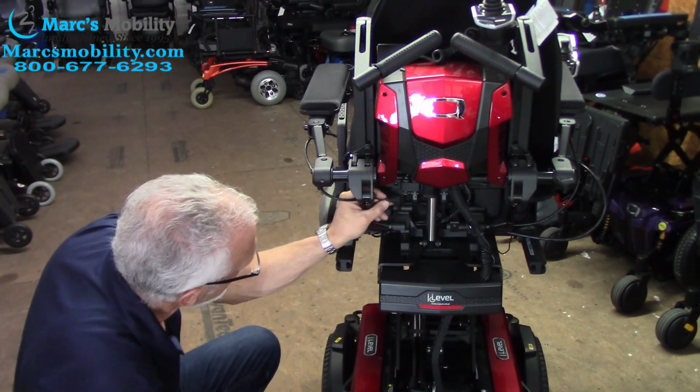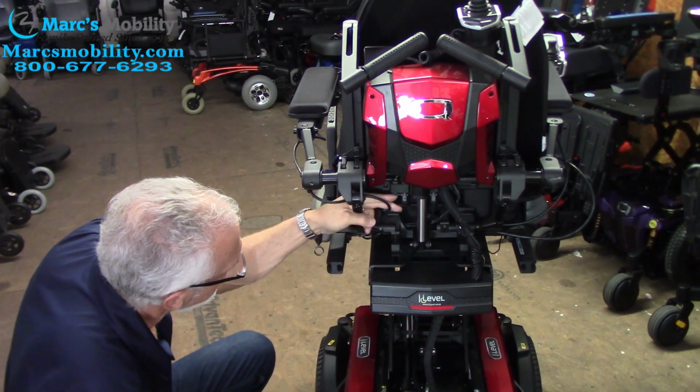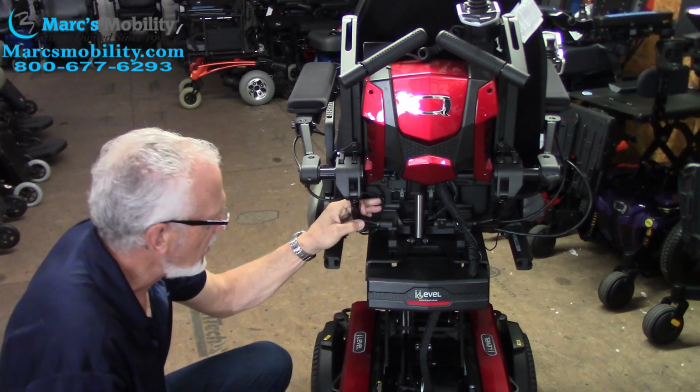Any of these two would work. If you might only have one here. Just plug it in one of these ports and you're ready to go again.